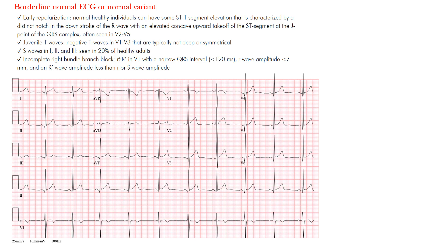Here's an example you'll find on the site. There are a few different things considered borderline normal or a normal variant. The first is early repolarization — a normal finding seen in healthy individuals. Almost half of people have some sort of ST elevation, along with ST-T segment elevation and a distinct notch used to differentiate pericarditis from early repolarization. Note that while early repolarization is considered normal, some studies suggest these patients may actually be at risk for arrhythmogenesis.